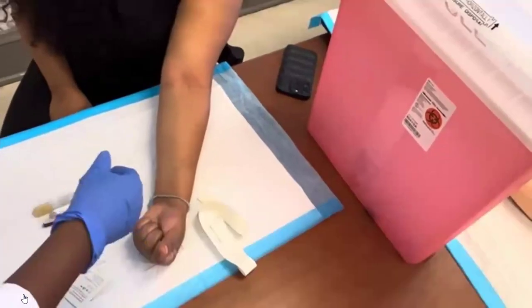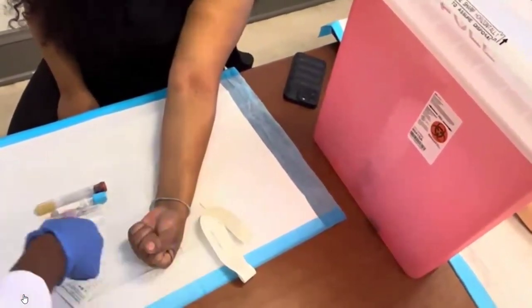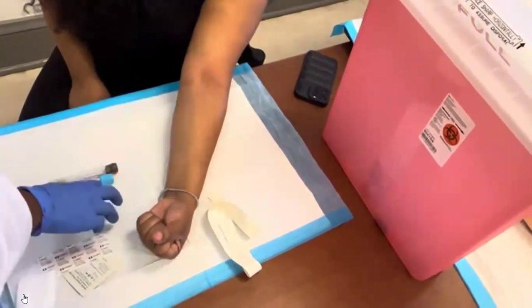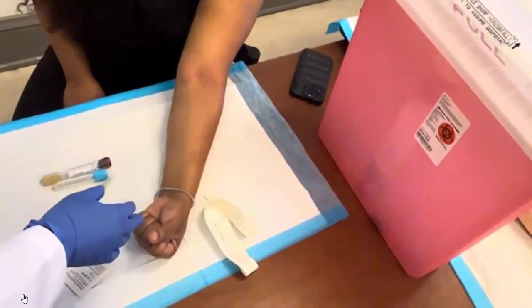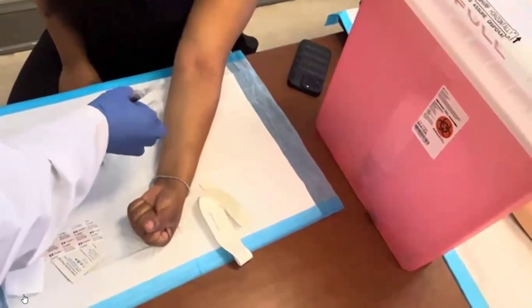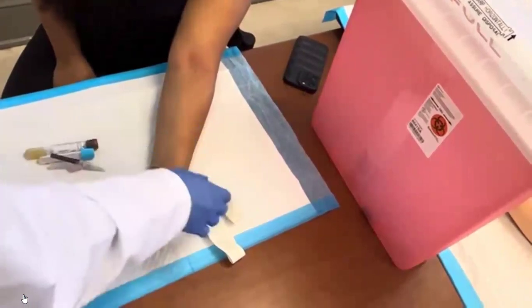So today we're going to be doing a phlebotomy lesson on a real live patient. First of all, I already have my supplies here. In real life, I would check her arm first to see which needle I need, because if they have a small fragile vein, or if we're doing a pediatric or geriatric patient, we would use a butterfly. But in this case, I'm doing a lesson on a straight needle with the Vacutainer system. Okay, so we're going to go ahead and get started.